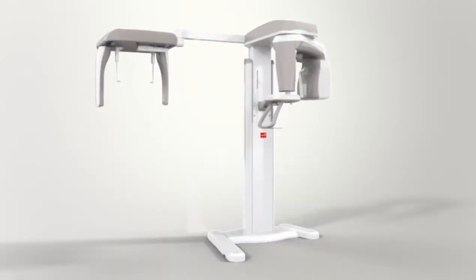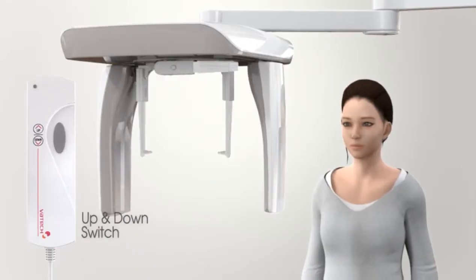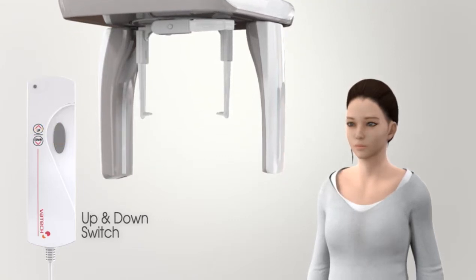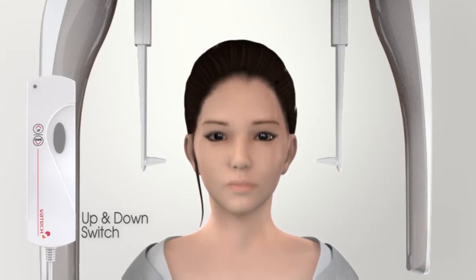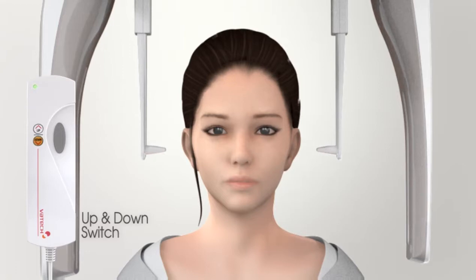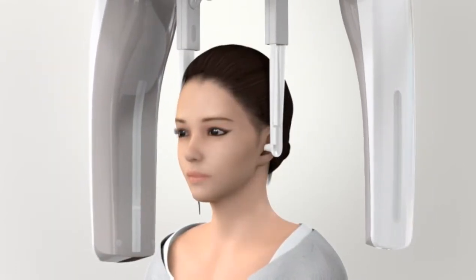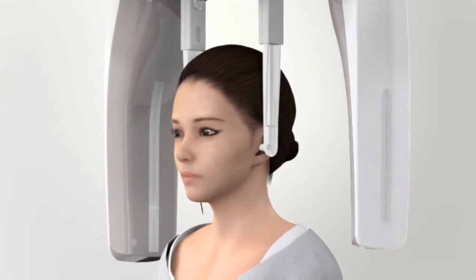Ask the patient to stand next to the Ceph unit. Using the up-down switch, adjust the height of the ear rod at patient's ear holes approximately. Guide the patient into the Ceph unit and place patient's head between ear rods. Using the up-down switch, position the ear rod at the exact patient's ear holes level. Tighten the ear rods and insert them into the ear holes to hold and fix the patient's head and height.